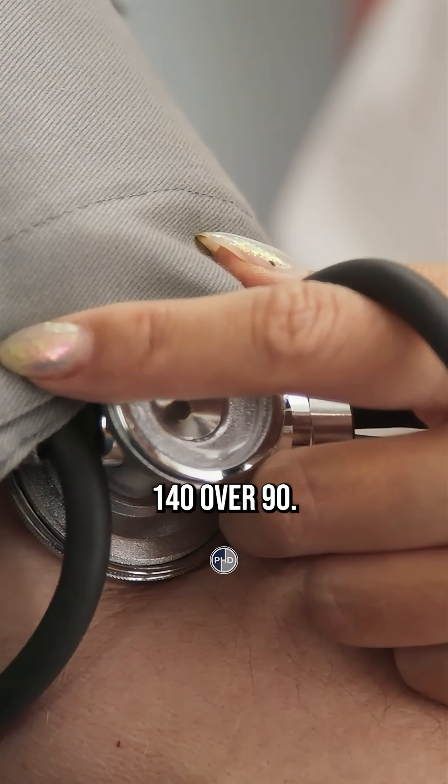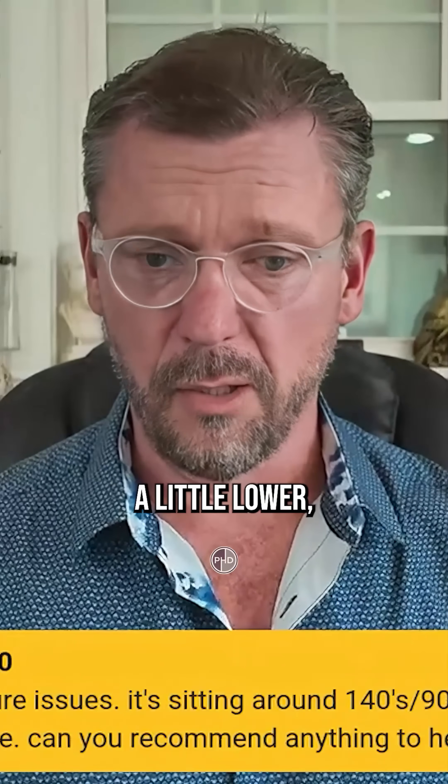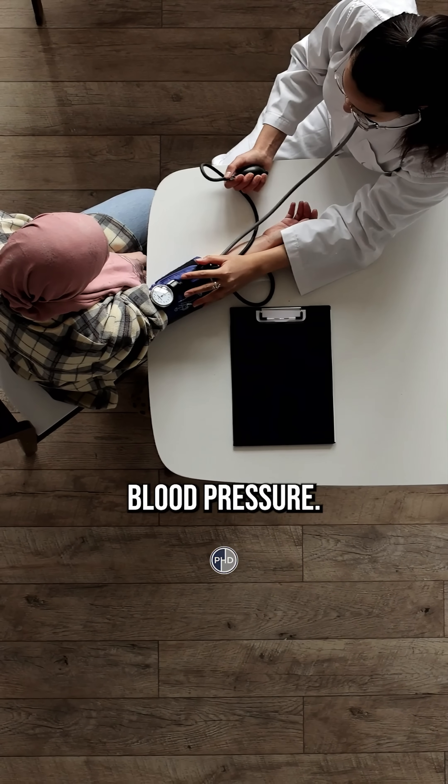Your blood pressure's not that bad. 140 over 90 is not bad. I'd like for it to be a little lower, but that's not terrible — it's not like, oh my God, I'm gonna die of blood pressure.